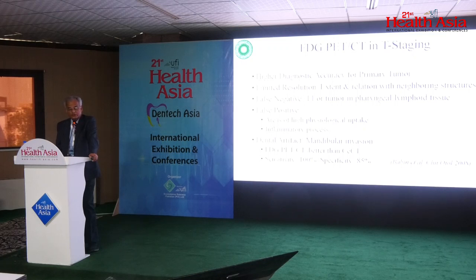Similarly, the false positive findings could be due to areas of higher physiological uptake and in patients who have a concomitant inflammatory process, because the basic limitation of FDG is that it is sensitive, but it is non-specific. It is taken up by neoplastic as well as glucose-dependent inflammatory and infective processes.